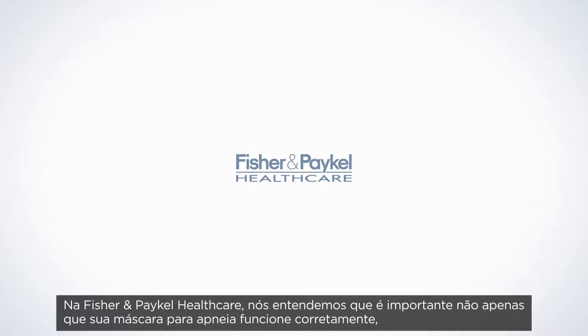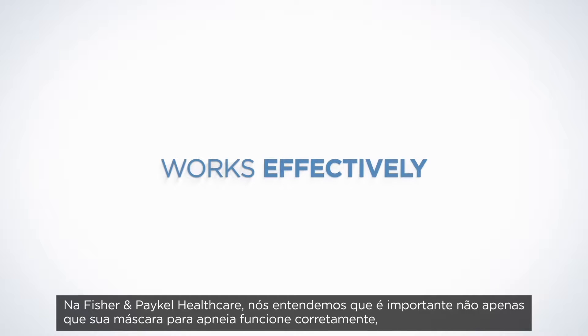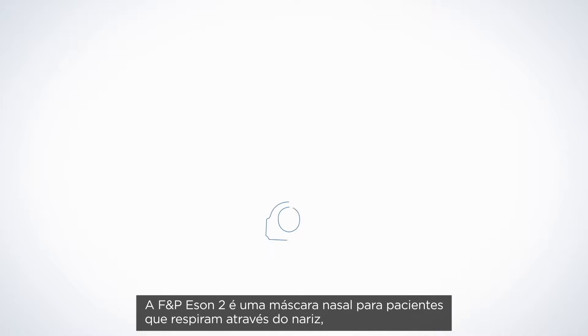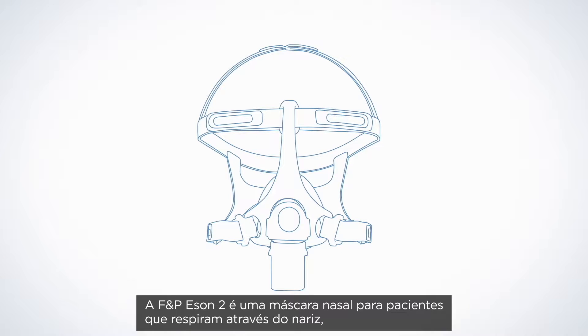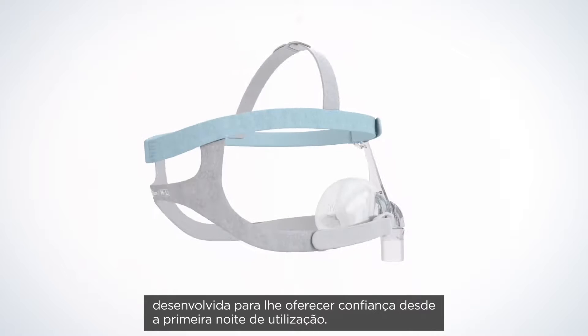At Fisher & Paykel Healthcare, we understand it is important that your obstructive sleep apnea mask not only works effectively, but is easy to use and to incorporate into your day-to-day life. The F&P Eson II is a nasal mask made for nose breathers, designed to give you confidence from the very first night.